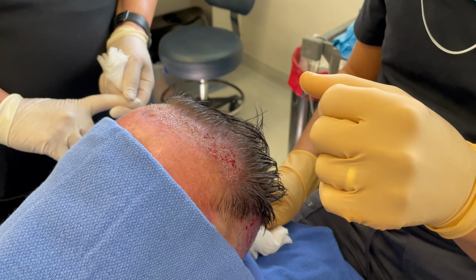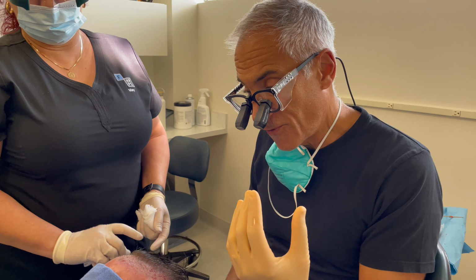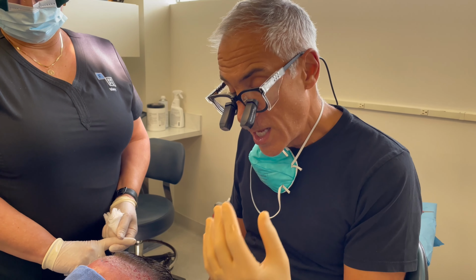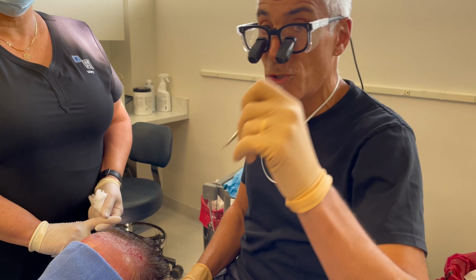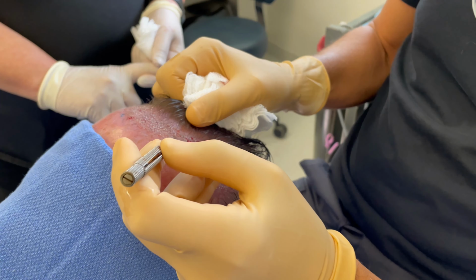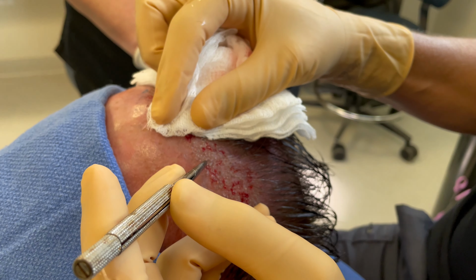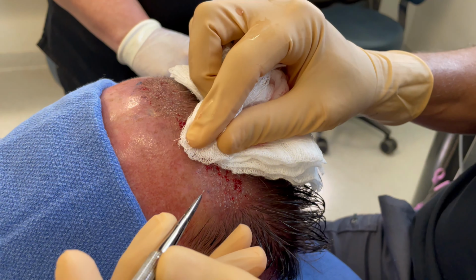We've already planted around 1,600 of the grafts, and now this is sort of the refinement. This refinement is to achieve optimum density or maximal density. I've already made most of my recipient sites how I typically do, using a 0.6 millimeter for my 2 hair grafts. It's a nice way to go ahead, and I can see all the little spaces. But now I want to go for maximal density. How am I going to do that?